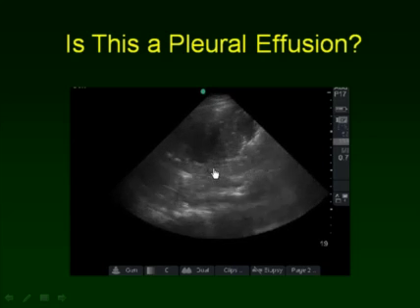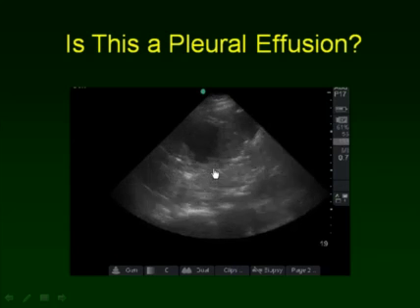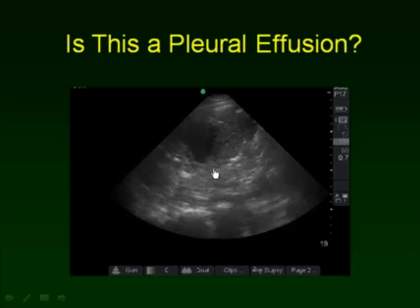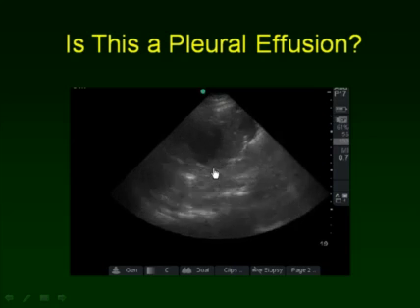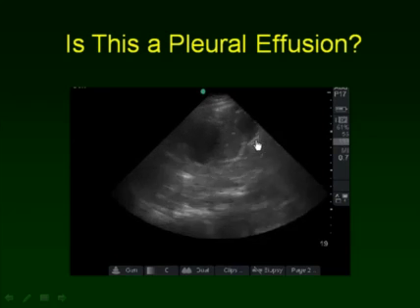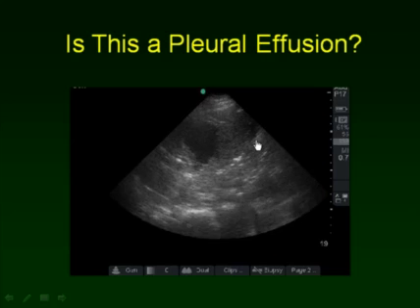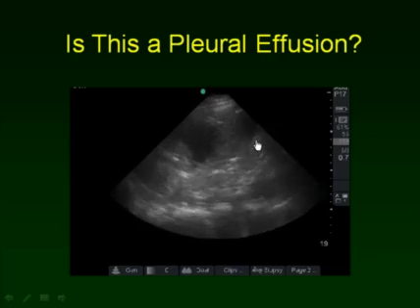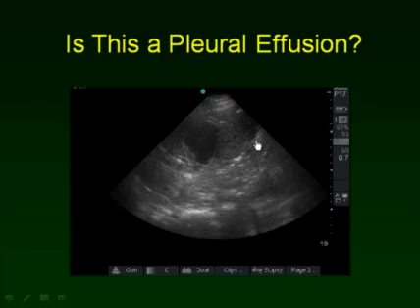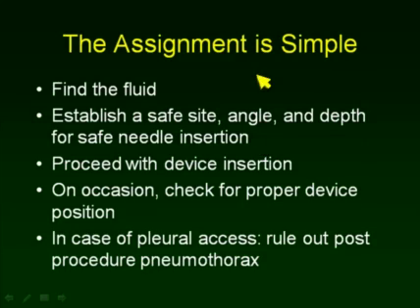But the examiner with standard skill level might want to back off on this one and say, I'm not completely sure. Perhaps it's time to define this space with CAT scan, because ultrasound is not definitive. So take care with hyperechoic effusions.